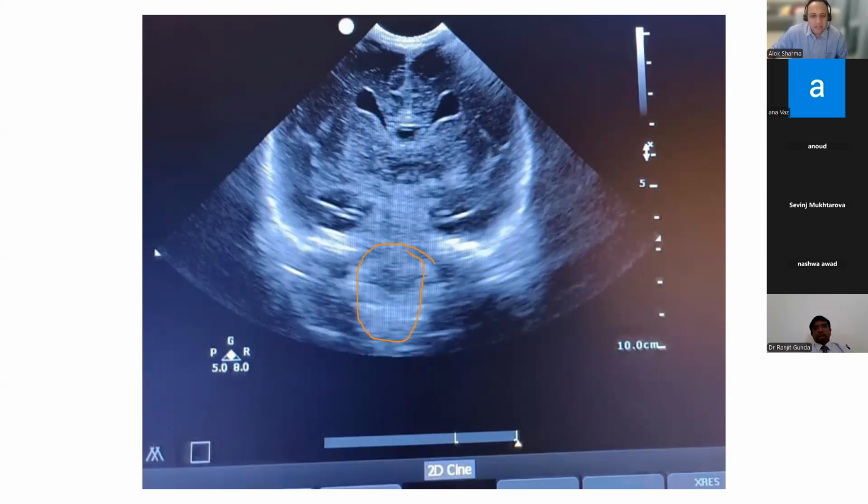So that's the only thing. Your focus, again, it's really nice. It's at the level of the ventricles. So very nice images. Well done, Doctor. Thank you.